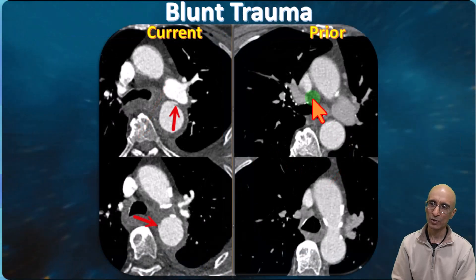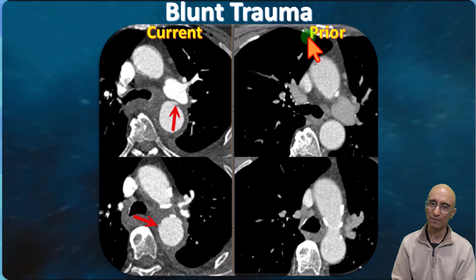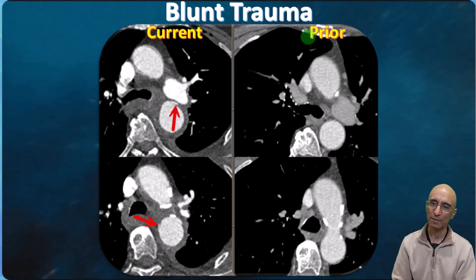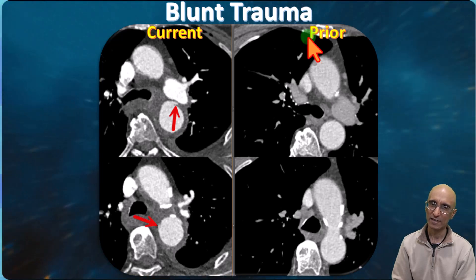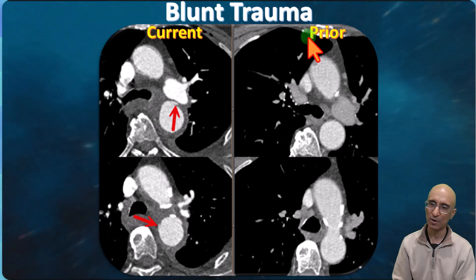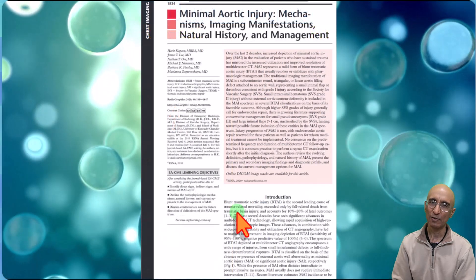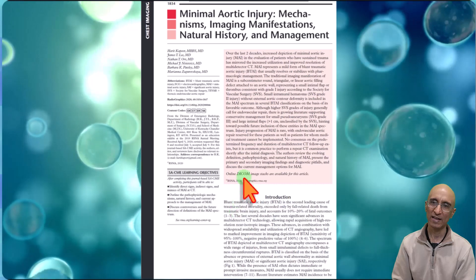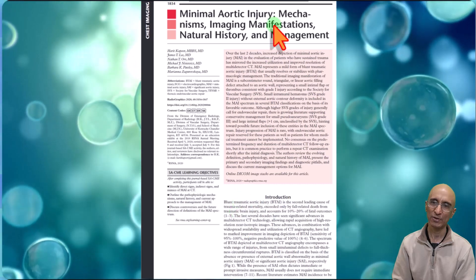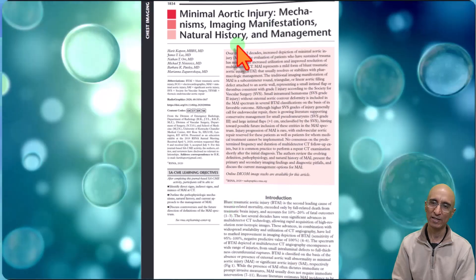Looking at comparison images from a CT performed many years ago, we can see these tiny intimal flaps were not present on the prior study. So our patient essentially has minimal aortic injury.